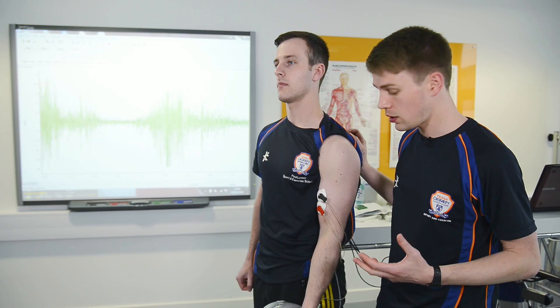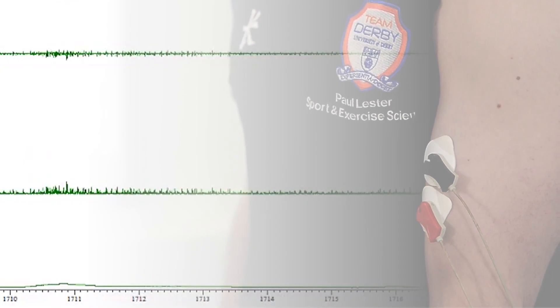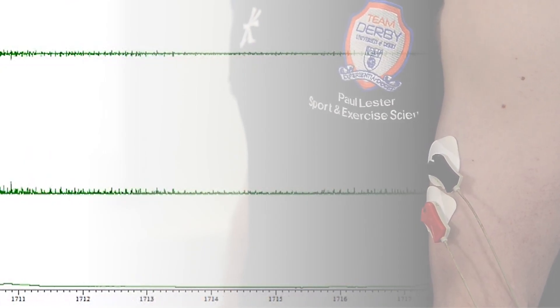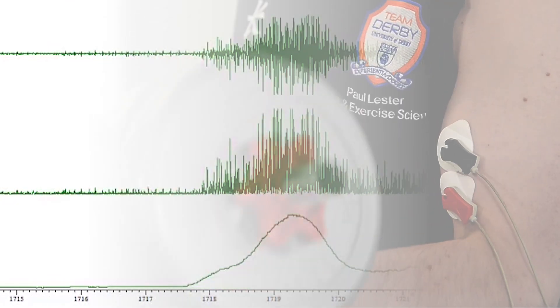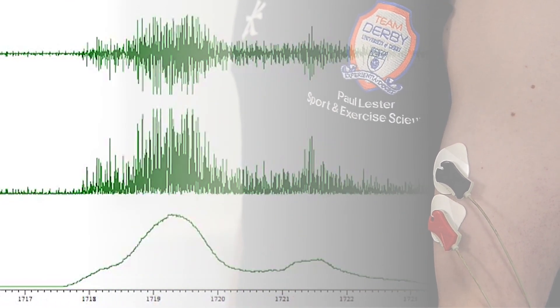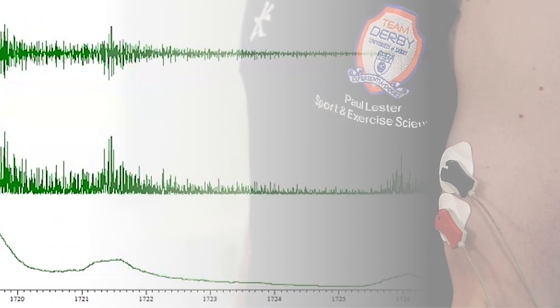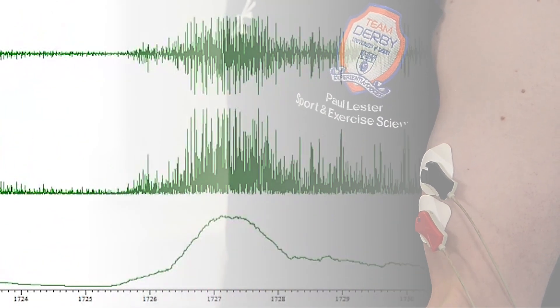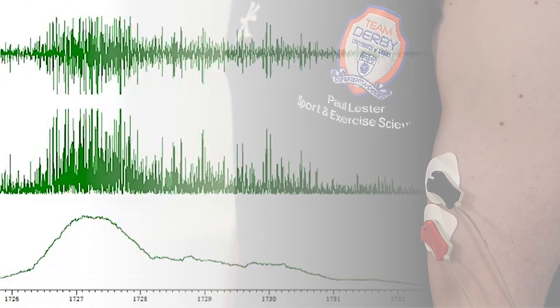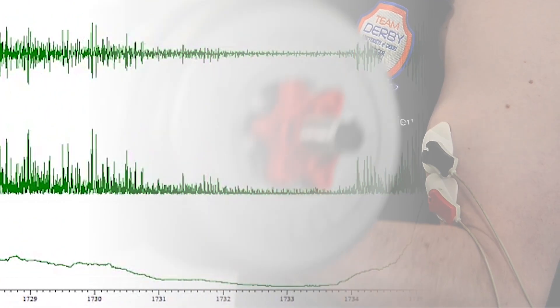So here, more motor units are being recruited in order to generate the extra force. EMG data is usually processed by firstly rectifying the raw data. This involves taking the absolute value of the data points, and can be seen on the middle graph, where all of the data is above zero. Filtering is also often used to smooth the signal. As shown in the lower graph, the data now appears as a smoother line, which more closely reflects the force generated by the muscle.